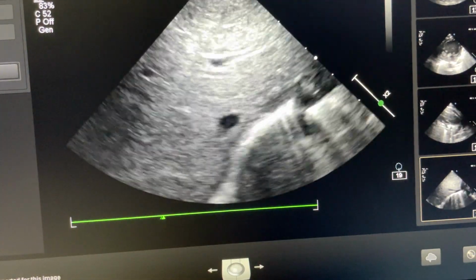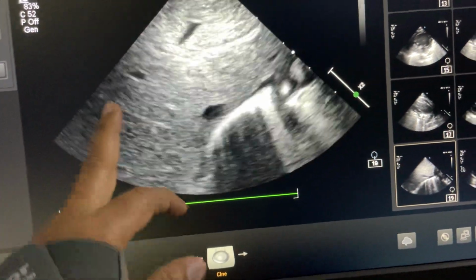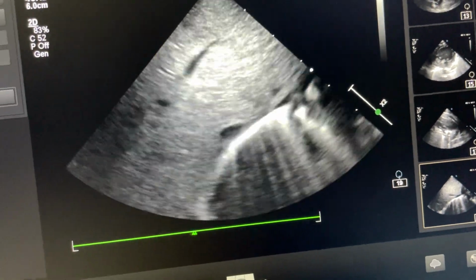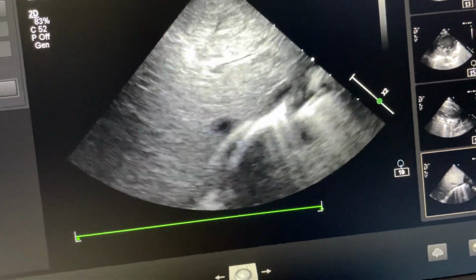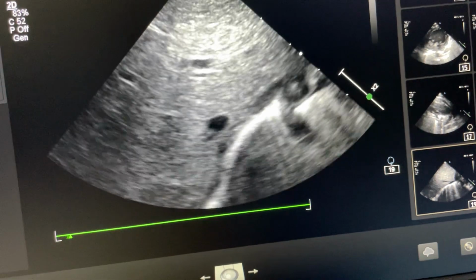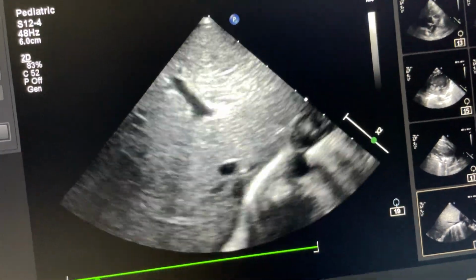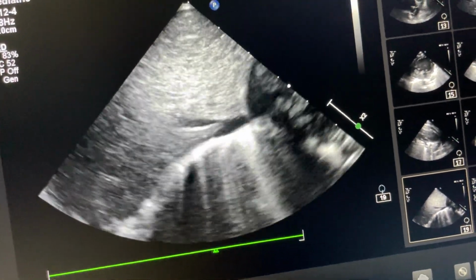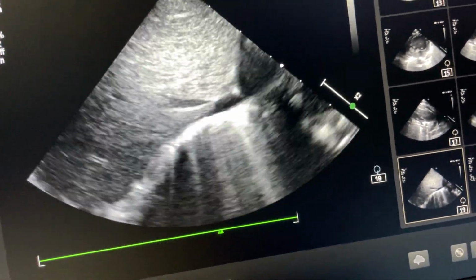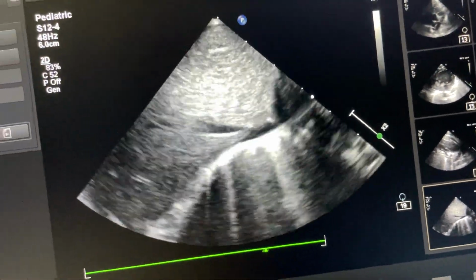Obviously the ventricle is large in size. You can see this is IVC, this is aorta, this is the right portion liver, and the left portion has a stomach. So situs solitus, normally related aorta and IVC. So this is a case of situs solitus, levocardia, normally related IVC and aorta. Ultimately the only abnormal finding is the single ventricle, that is to say the very large VSD, and the right ventricle has almost no development except the right ventricle outlet portion.